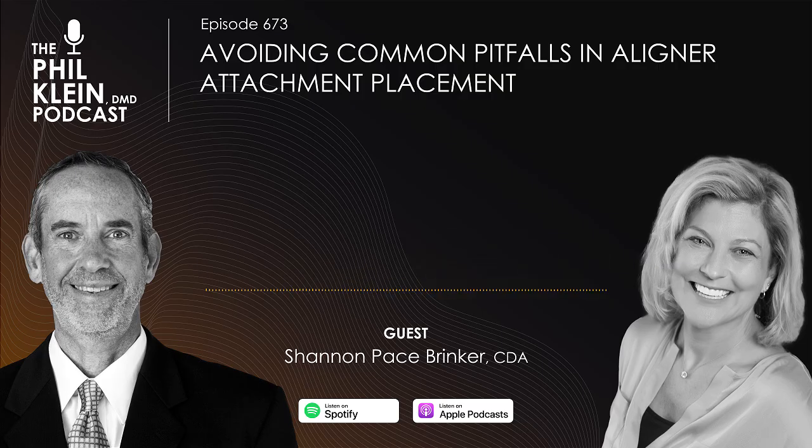And so when I pack this into that attachment template, my good friend Howard Strather, I know you know Howard very well. He developed the Optra Pad. That was his baby, and he doesn't even really talk about it that much. But the Optra Pad is an amazing instrument. I use the Optra Pad. It has a flat base to it, so it's like an IPC on one end, but it's got a flat, beautiful, flat disposable end that I can push that composite into the attachment template.